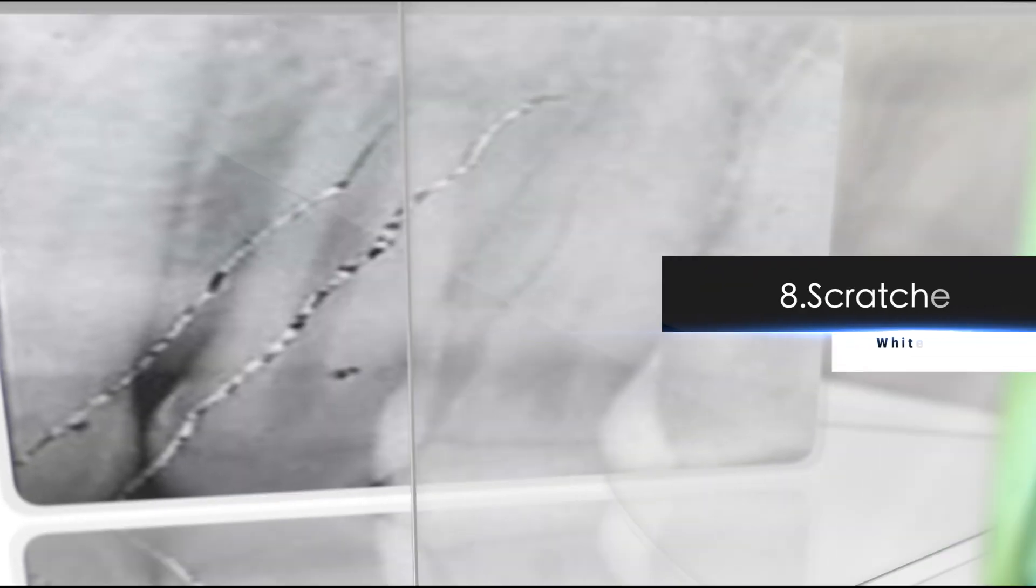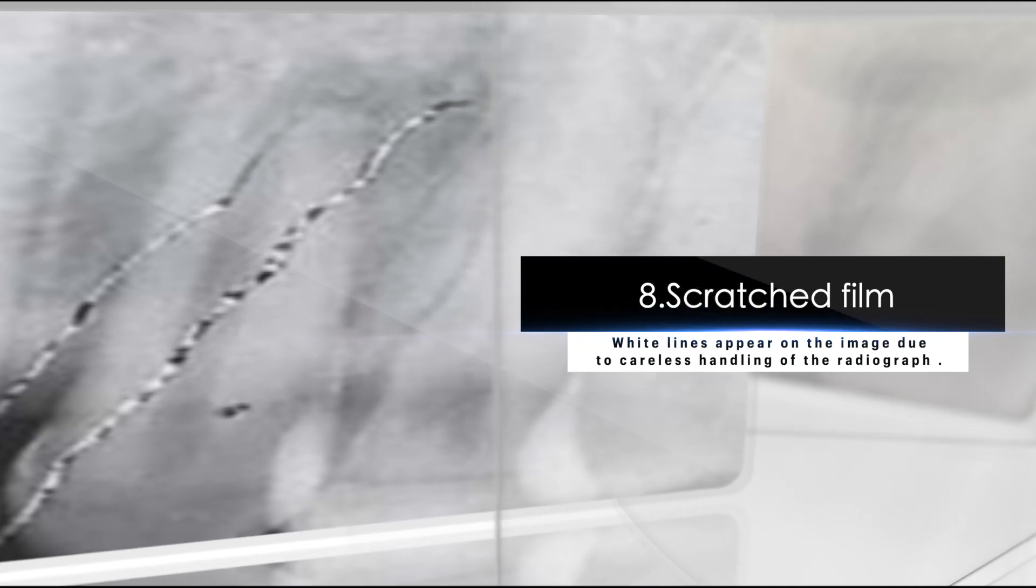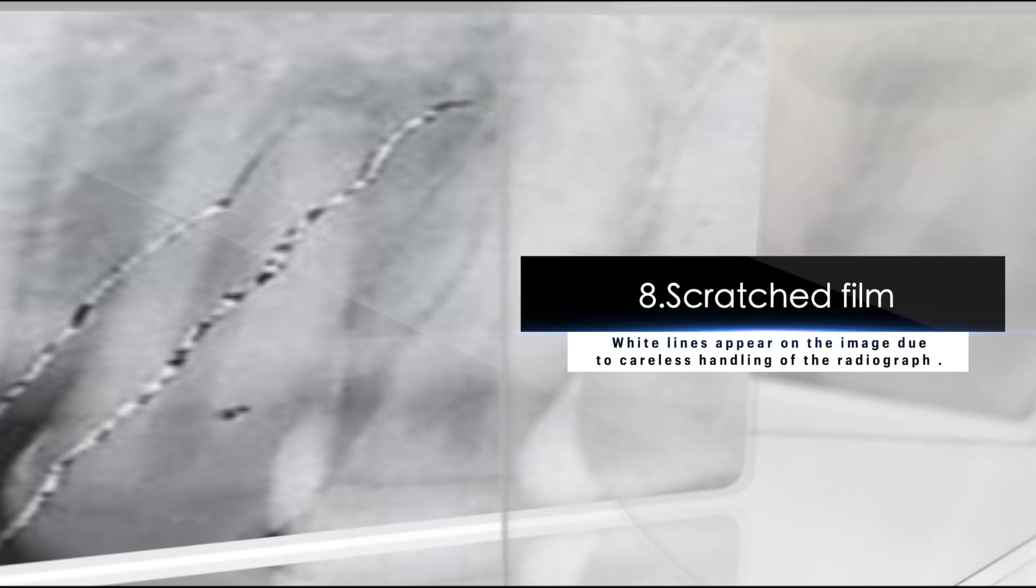Eight, scratched film. White lines appear on the image due to careless handling of the radiograph.